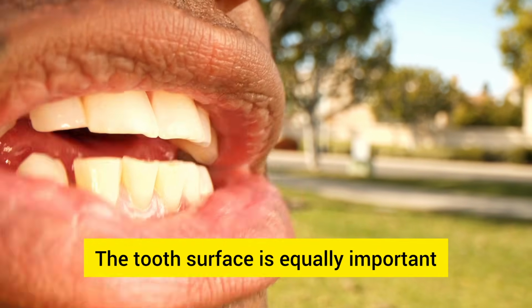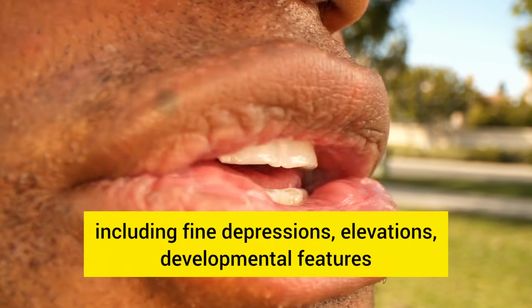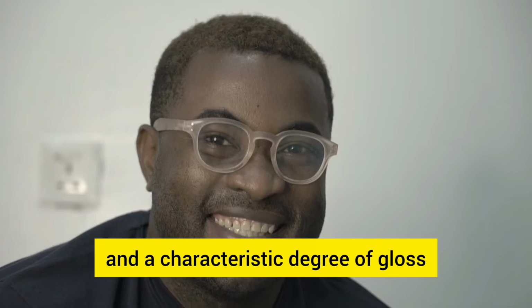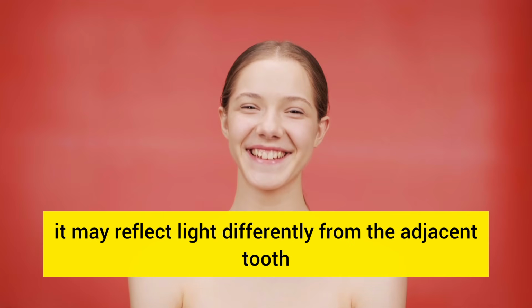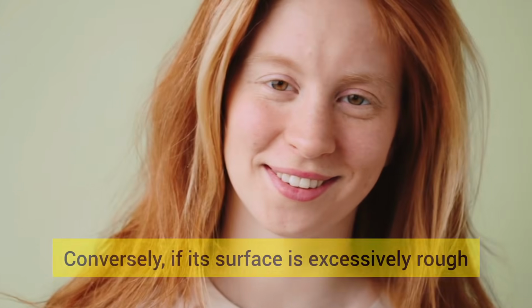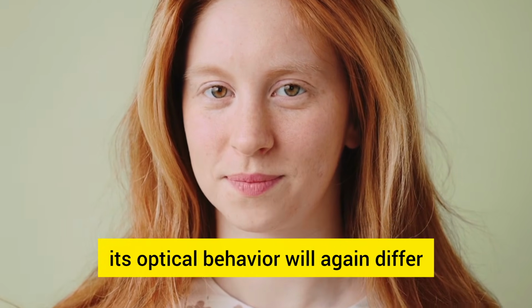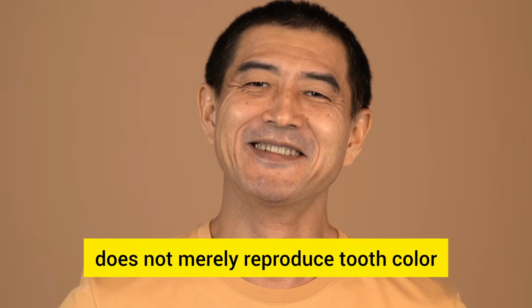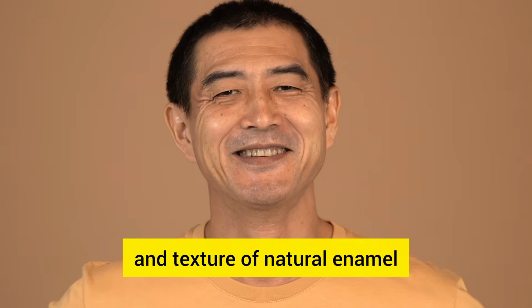The tooth surface is equally important. Natural enamel exhibits subtle surface texture, including fine depressions, elevations, developmental features, and a characteristic degree of gloss. If a crown is perfectly smooth and excessively polished, it may reflect light differently from the adjacent tooth. Conversely, if its surface is excessively rough, its optical behavior will again differ. An exceptional dental technician, therefore, does not merely reproduce tooth color. They also attempt to recreate the surface morphology and texture of natural enamel.